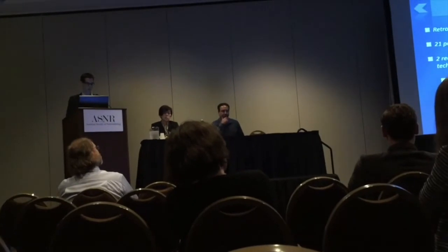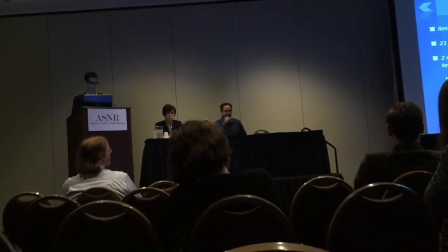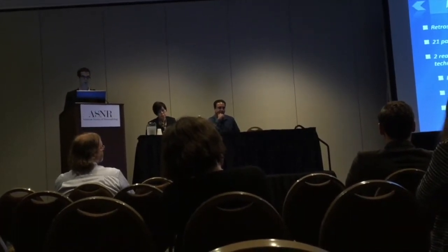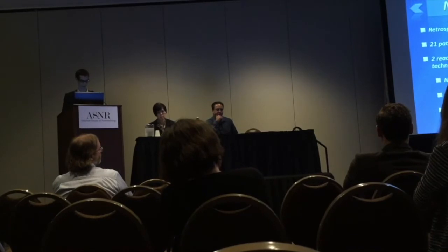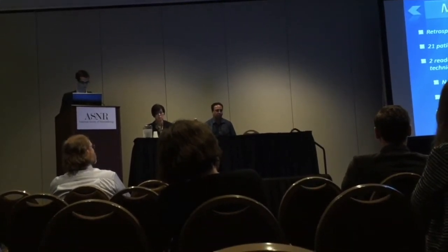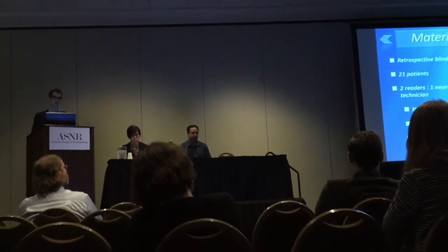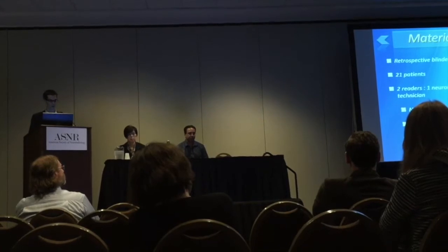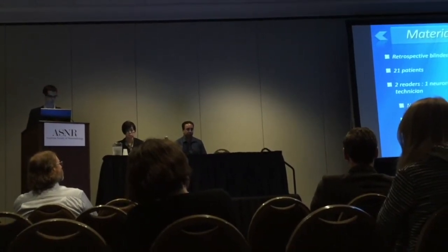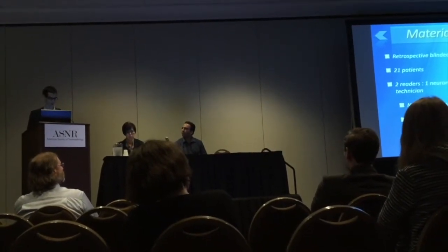We then conducted a retrospective blinded study to evaluate this technique on 21 patients who had successive MRIs in our imaging center. For each anonymized patient, we assessed dissemination in time using frame-by-frame comparison and FLAIR fusion at different times, to avoid the results of the first technique influencing the second. A neuroradiologist and an MRI technician, who took the role of the new resident because we don't have residents in a private practice center, participated in the study.